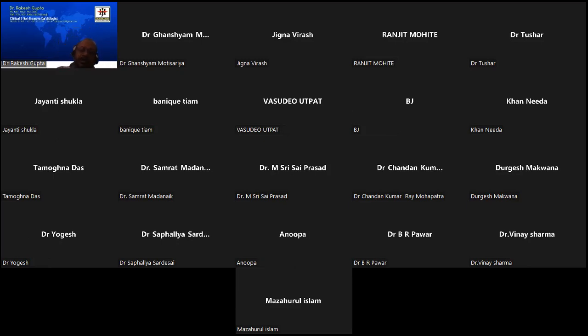And believe my word, the first formula, the mitral annulus calculation along with mitral valve VTI minus LVOT VTI and LVOT area volume, is much more correct than the stroke volume of the LV, because LV is dependent on our measurements, since end diastolic volume minus end systolic volume is what we trace. Here we are not tracing anything. So the first formula is more appropriate than the second formula. All right, Nida? Yes, sir.